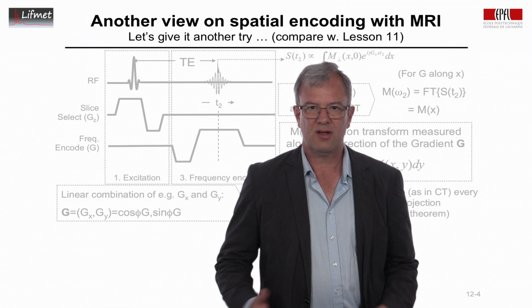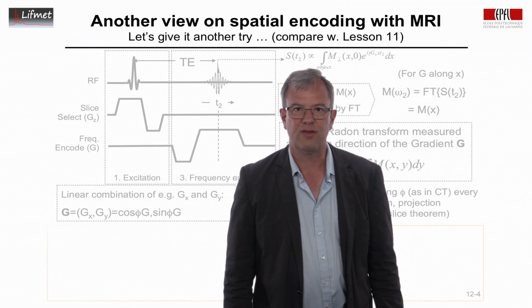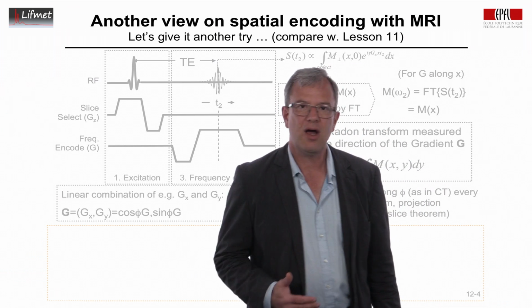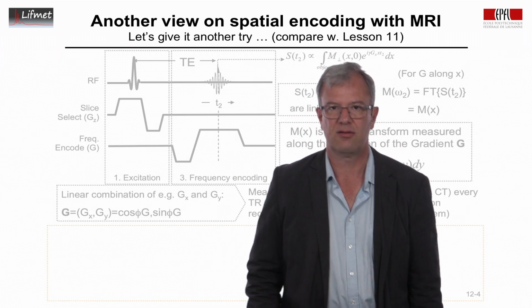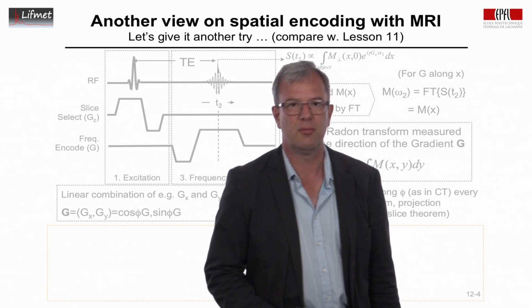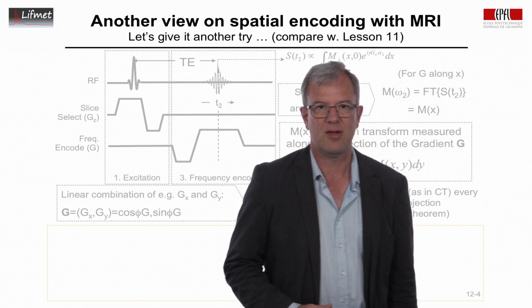Okay, so if this helps you, now I'm going to look at the phase encode gradient, because MRI reconstruction and data acquisition is rarely done using the Radon transform approach. There are some applications, but they are the vast minority. The major way of obtaining the image is by two-dimensional encoding using the phase encode gradient.